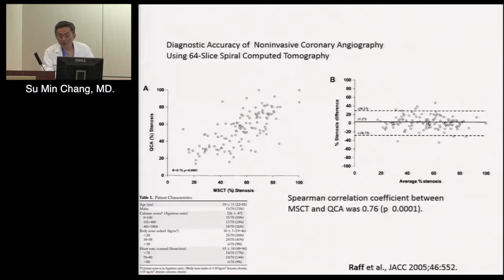Okay, so we need to know our limitation. You can measure all you want. You can call 35, 33% if you want. Same thing with the vessel diameter. You can call a vessel 2.5 millimeter, 2.3 millimeter, but we cannot be that confident in calling with that amount of precision.